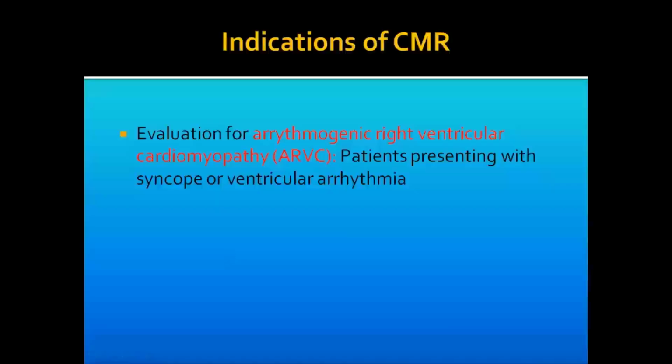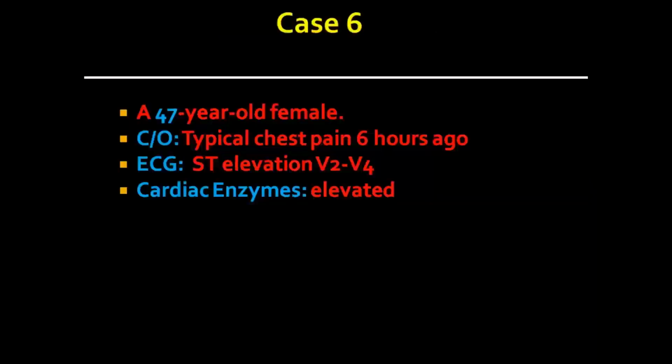So ARVC, it's a classic indication of ARVC. So if you suspect ARVC, send the patient to CMR. This is another example of a 47-year-old female.